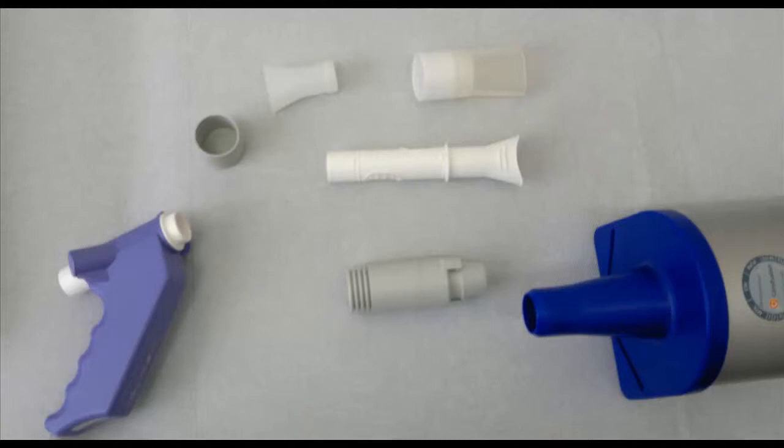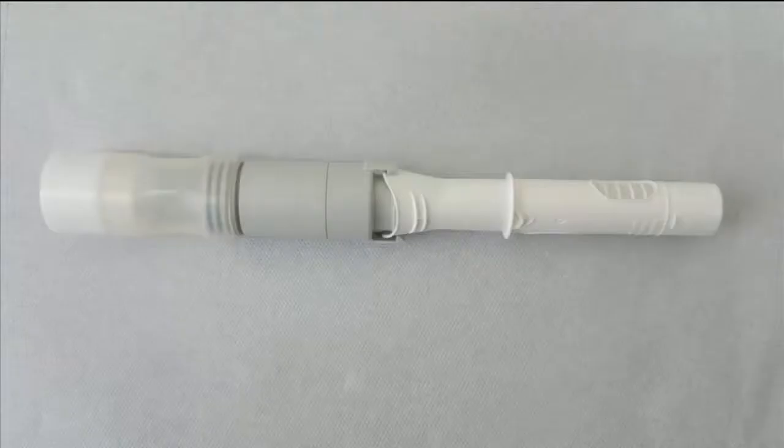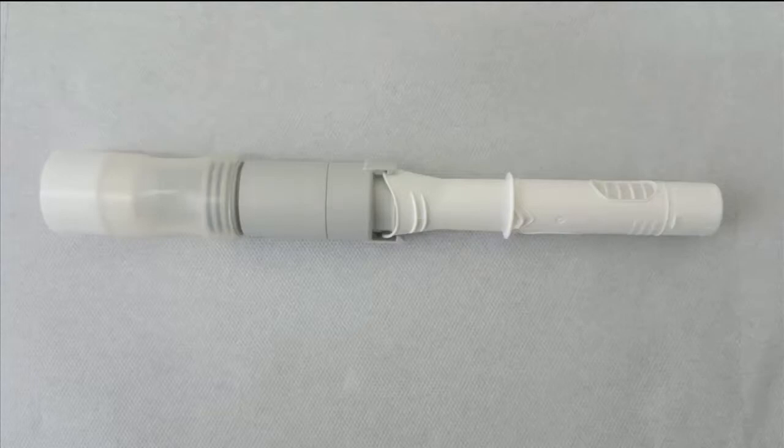These are the components that make up the adapter. You need to place these together as shown in the image.